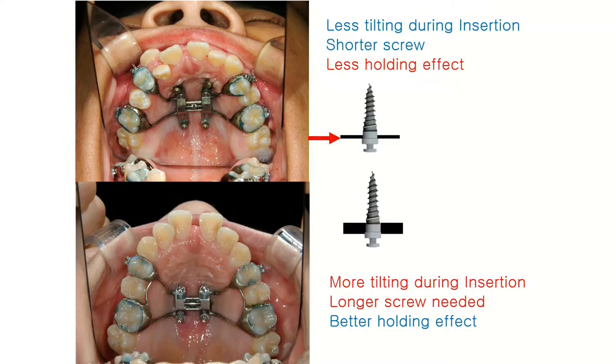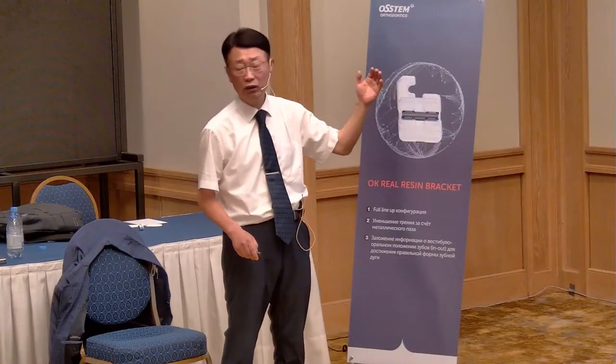But when you turn the screw to expand, maybe the thick one is much better at delivering the force to the bone.